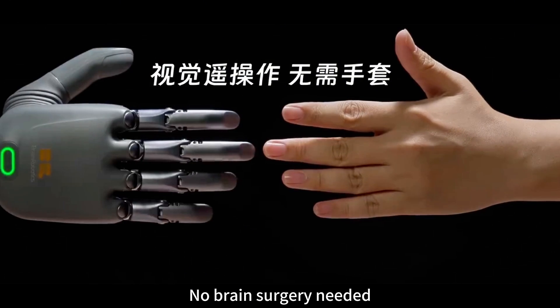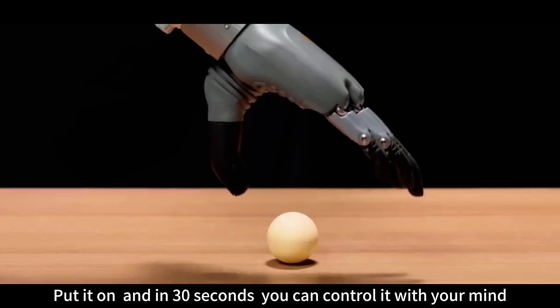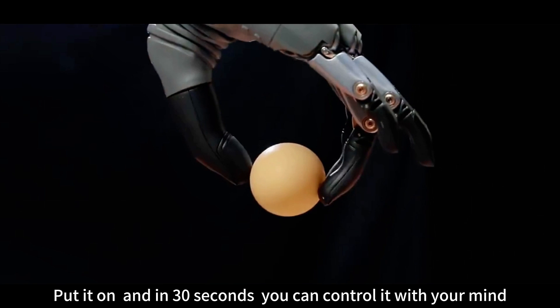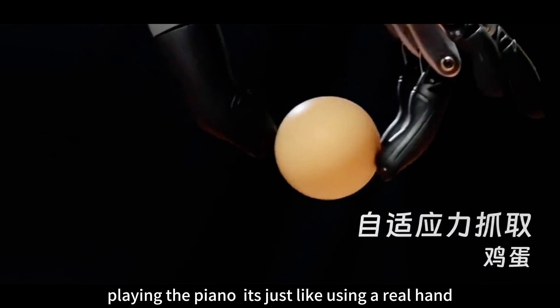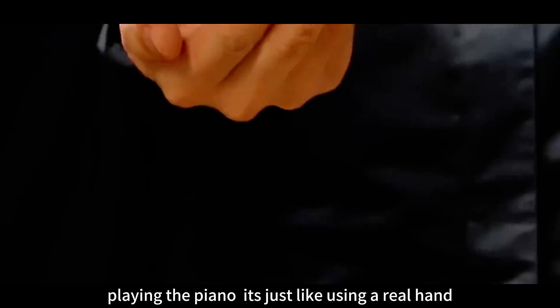What's even more amazing? No brain surgery needed. Put it on, and in 30 seconds you can control it with your mind. All five fingers move independently — writing, playing the piano. It's just like using a real hand.